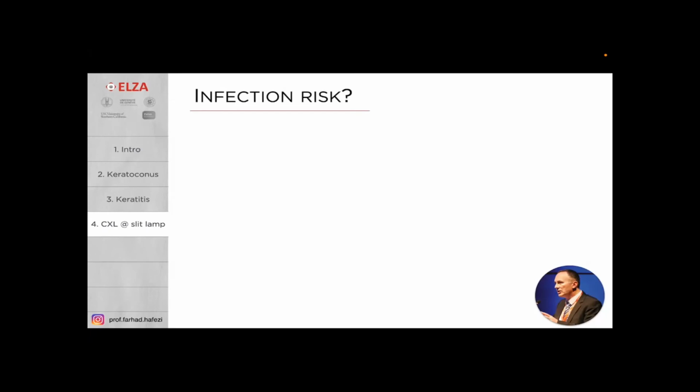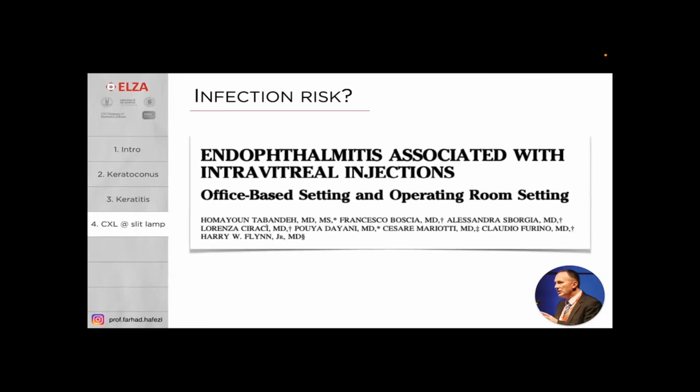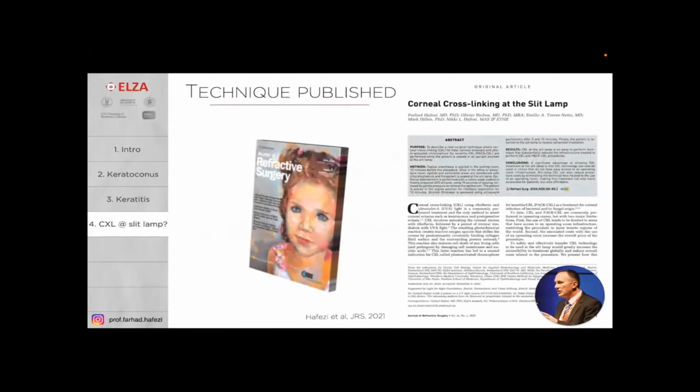And please don't forget, our retinal colleagues are even switching intravitreal injections into the examination room, not in the procedure room, into the examination room. So this is totally feasible for cross-linking. We have published the technique of CXL at the slit lamp in the JRS last year.